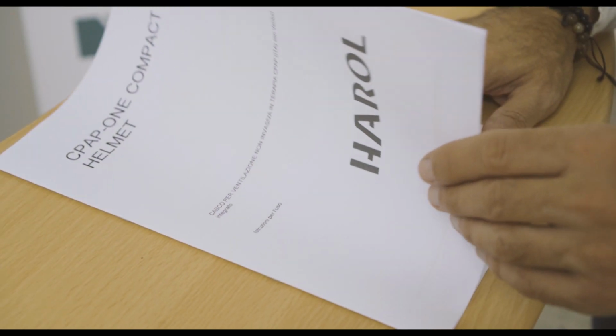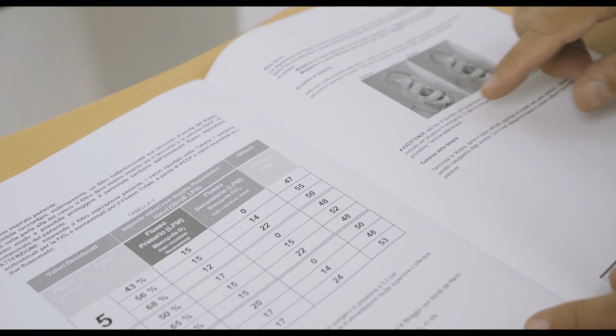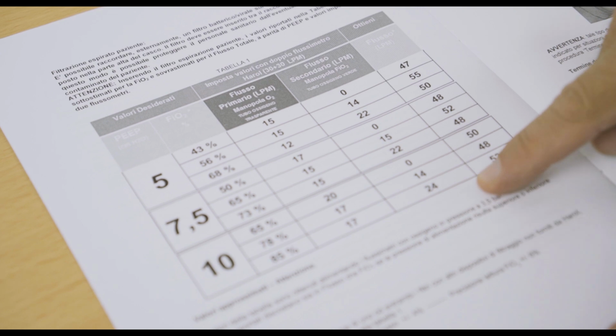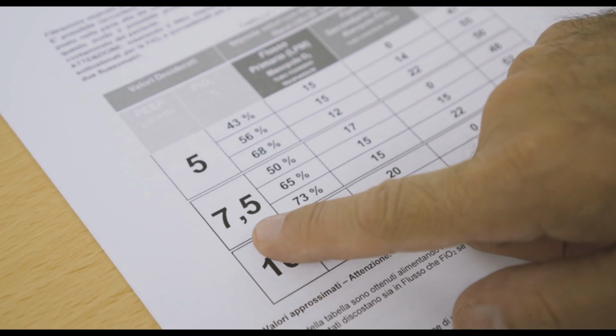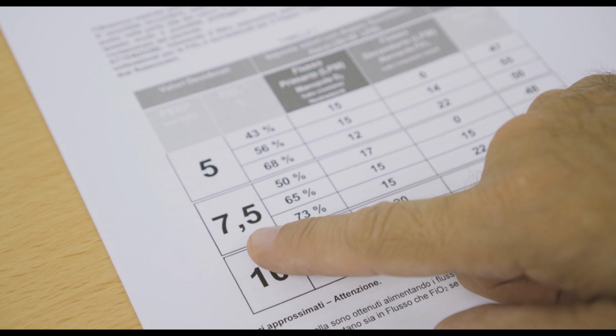Harol provides tables to be able to adjust the oxygen fraction supplied to the patient based on the PEP in use. For example, with a 7.5 valve, if I want to provide the patient with 65% FiO2, I will open the 2 flow meters at 15 liters per minute, and I will have an output of 52 liters per minute.